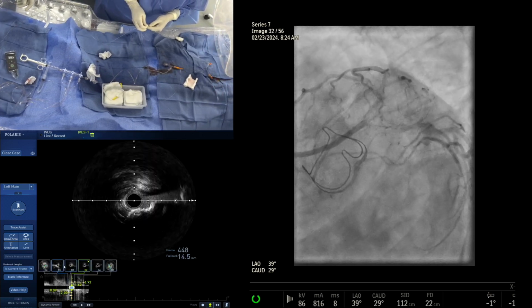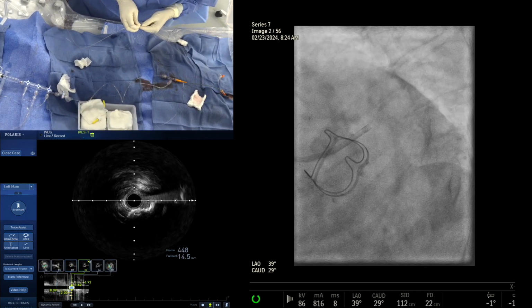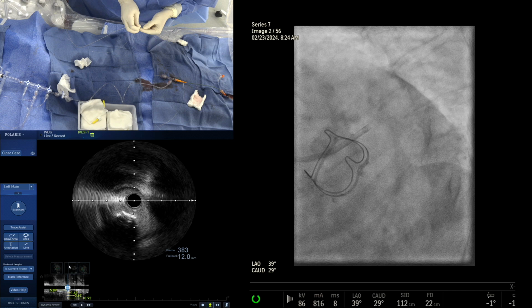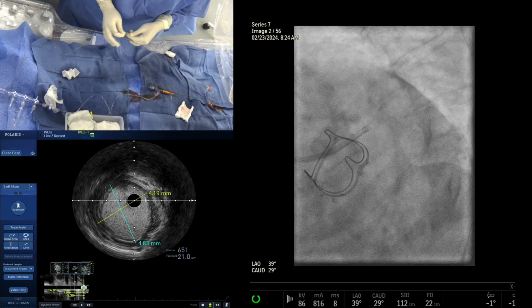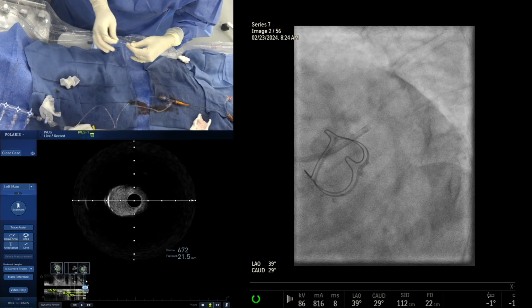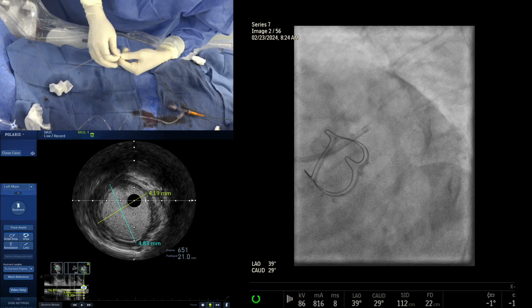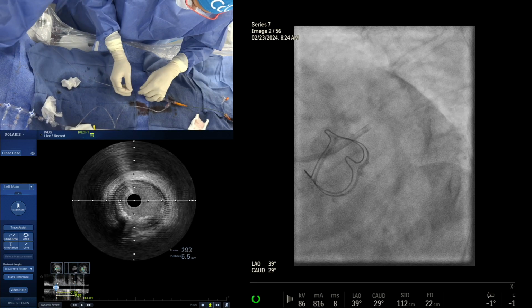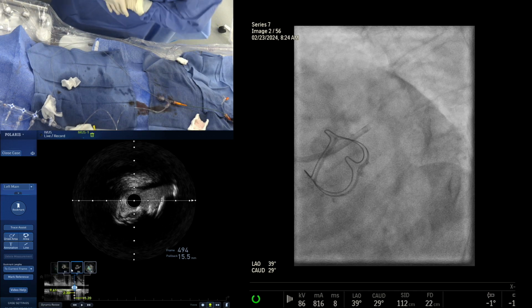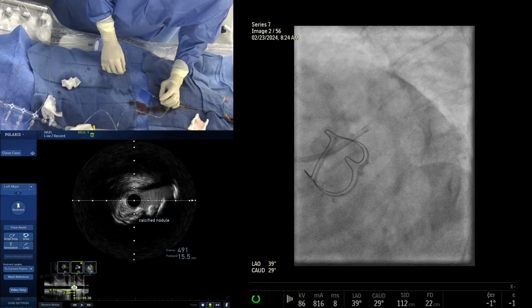Beautiful. And we should ask our audience also, put a question in the chat box. One more question: how to get the favorable bias? Suppose what kind of wire you use? Is it a floppy or more of a support wire? It's a very good point. So the key is that I think there will be already enough bias, but yes, extra support wire will give you more bias. And so we usually, the teaching will be that we'll use a floppy wire in this case. Now, by using extra support, would you get a little more bias? I think probably, but to me, I think the floppy wire will give you enough bias in the inferior aspect and be able to do it.